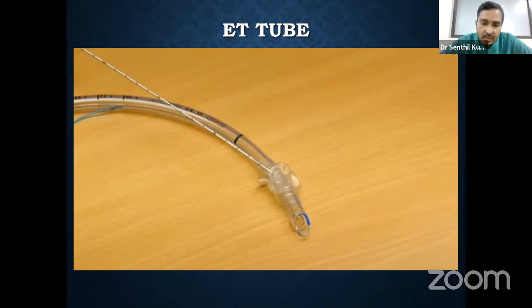The other additional uses are to provide adequate positive pressure ventilation, to avoid leak so that adequacy of ventilation is achieved, and to avoid airway and theatre contamination. If there is a leak, it is going to produce contamination by whatever gases we use also. Nowadays, whatever cuffs are available are high volume, low pressure cuffs. In the next successive slides, I will enumerate a few things about the cuff and the pressure it has to exert.